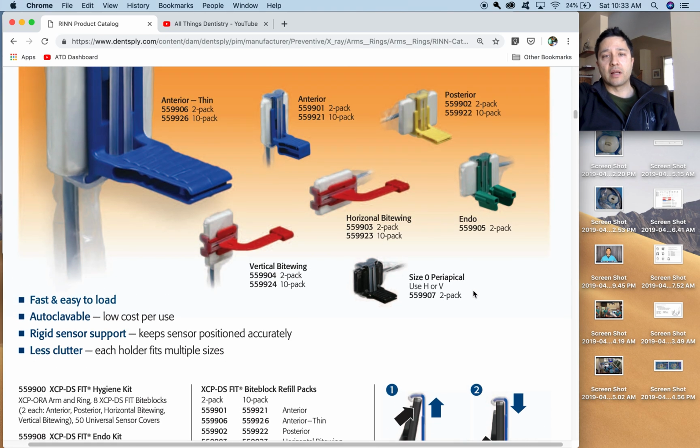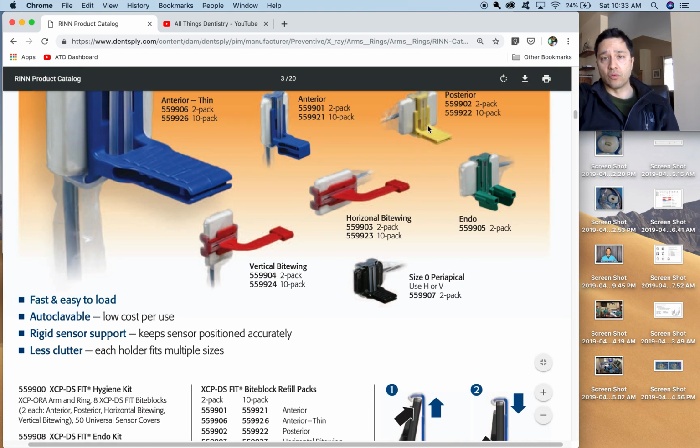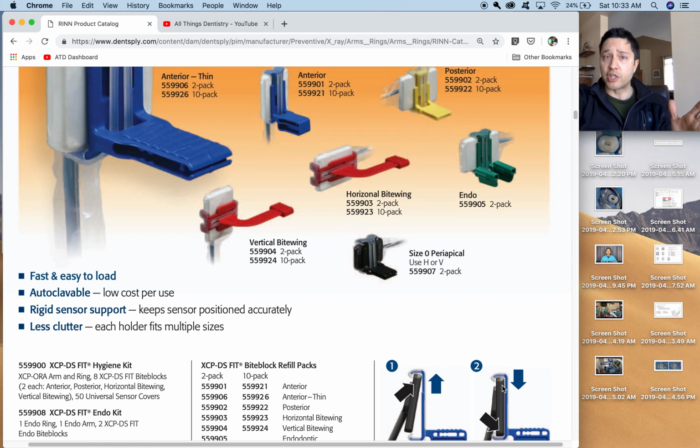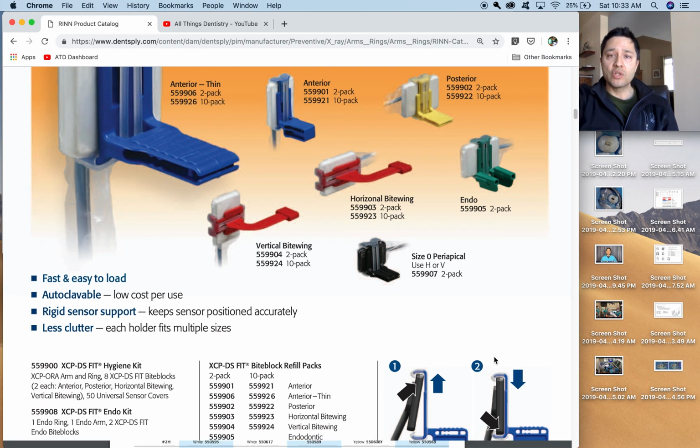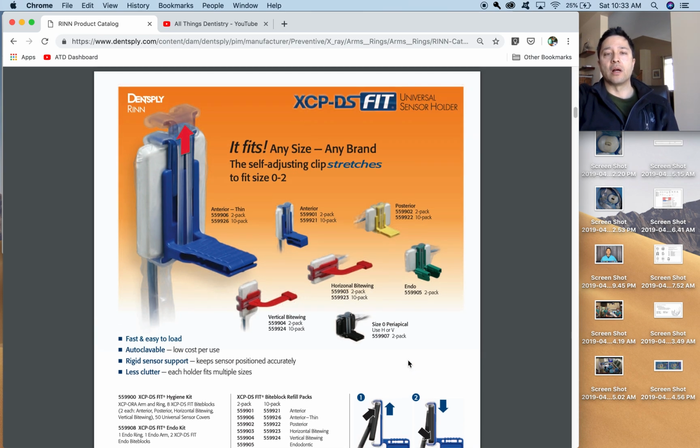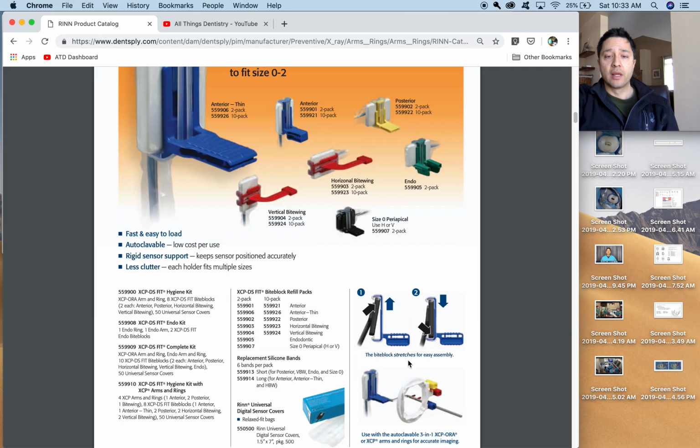So we have these types of sensor holders for just a paralleling device. You essentially clip the sensor, push up the elastic band, and then put it down, and it seats. And that might be so much easier. So I might actually say forget the other one and try with that. What I'm going to do is on Monday, I'll get a couple of these ordered in, and let's try them out. That might be a lot easier. And then, like I said, this is for the direct, wired sensor like a Schick.